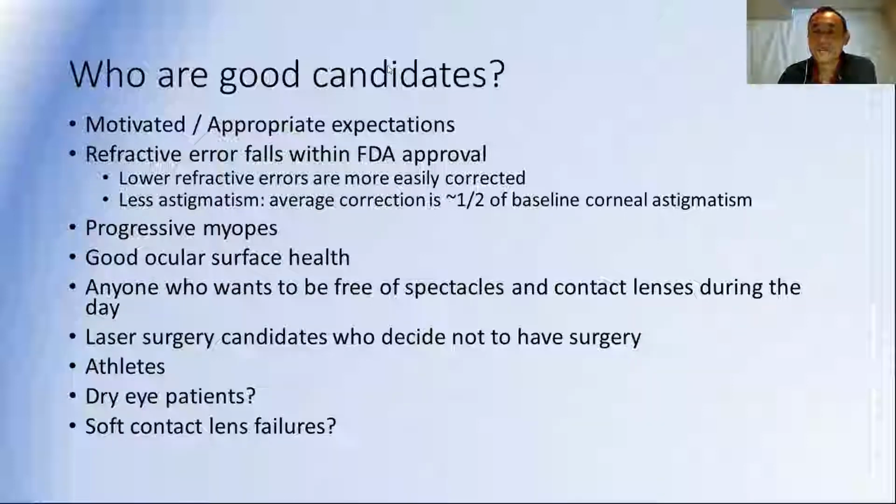When should we stop Ortho-K treatment? Excellent question. I don't have a good answer for that. What I've been telling parents of children is that typically, patients stop becoming more myopic sometime in their late teens and early 20s.